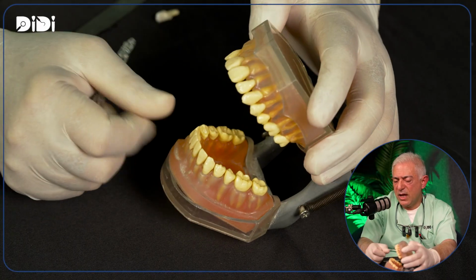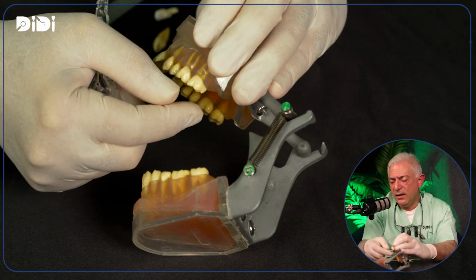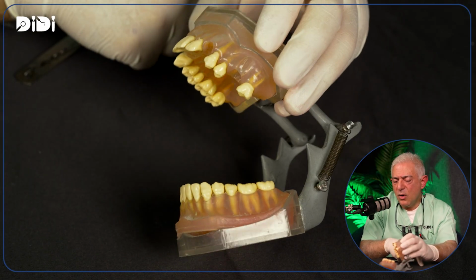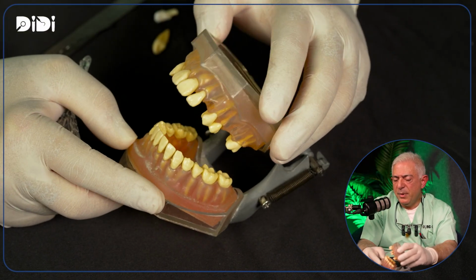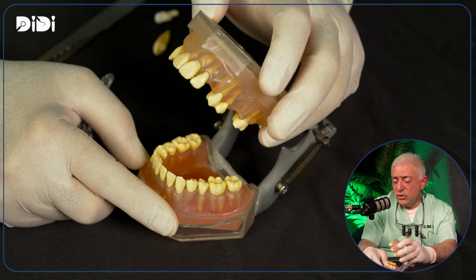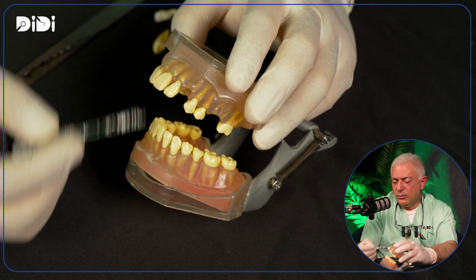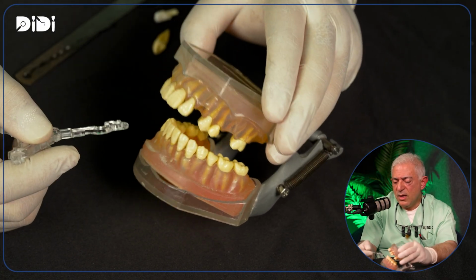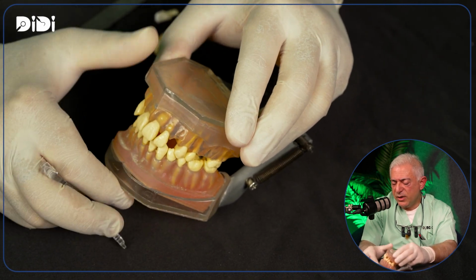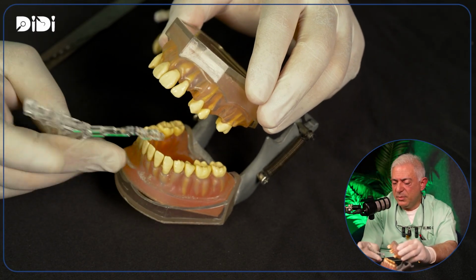Now imagine this patient came with a few missing teeth, say a lateral, a canine, and a molar, for example. Now imagine the patient wants to know if you can place an implant or not. Generally, you need to make an impression, send it to the lab, get a wax up because it's a front tooth, and so forth, and to check the vertical dimension. If you cannot measure it in the mouth, again, you need an articulated model. Now imagine all that can be done.